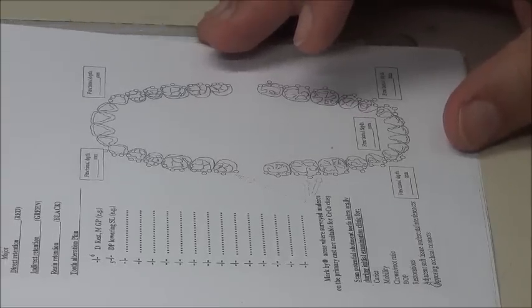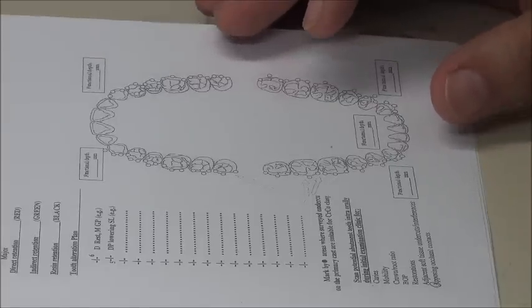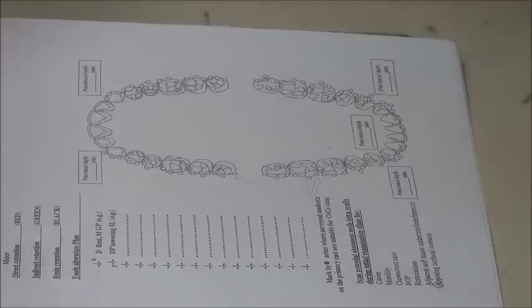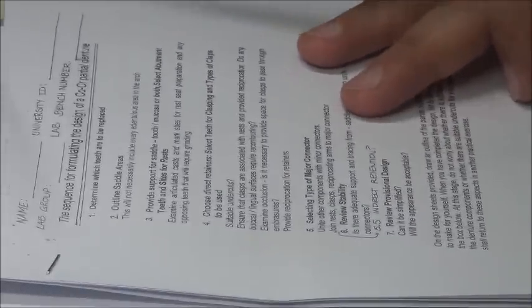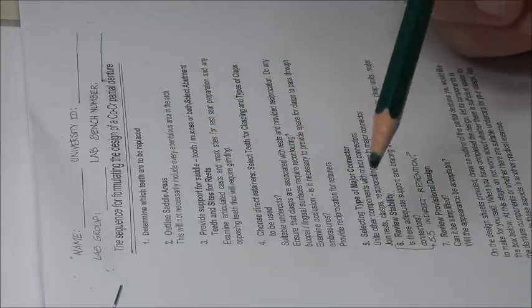So the empty form that we're going to fill in is always accompanied by the first page. It's the sequence of surveying on this side, the sequence of surveying of casts on this side. And then the steps for chrome cobalt design are included on this side, okay? This is to remind you of each component, so you don't forget it while you are doing your design. It also gives you some indication on how to review any design, okay?